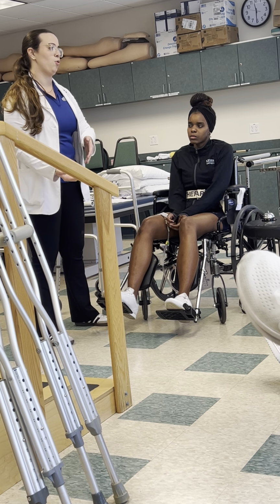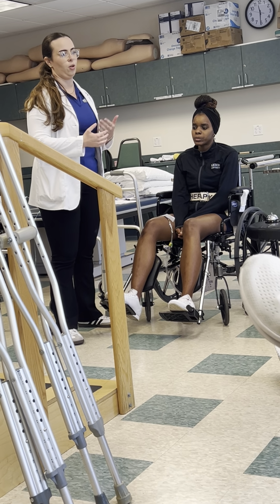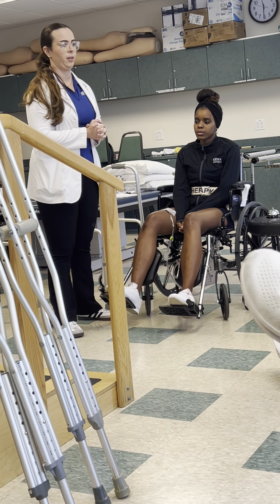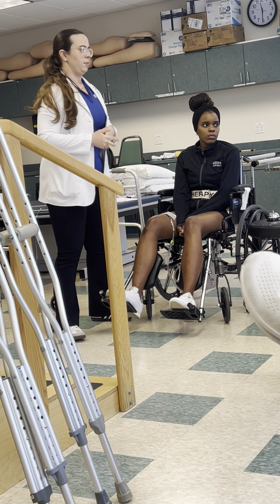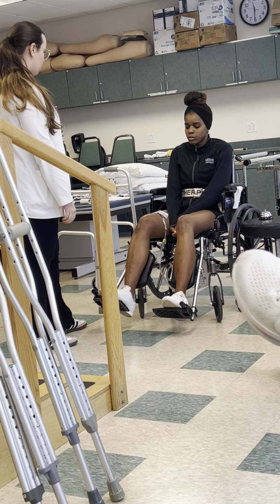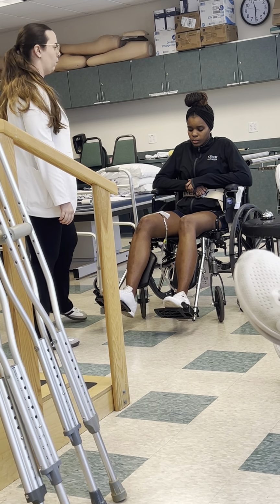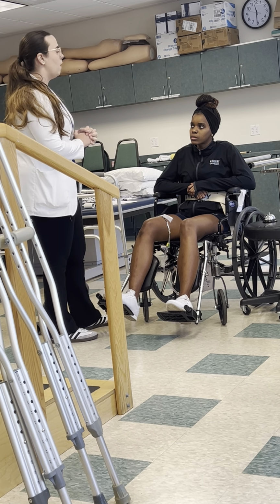Then after they've been transferred, you can wheel them over to the parallel bars and start your procedure from there for the partial weight bearing. Thank you. Clear? Did it make sense? Okay, awesome. Alrighty, so Amy, we're at level of assistance. I've communicated level of assistance, my patient is partial weight bearing.